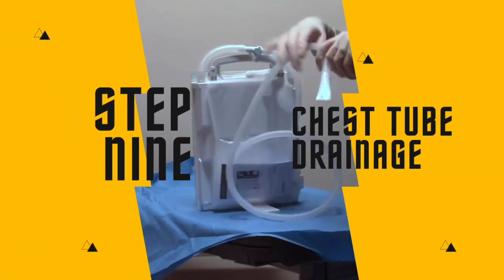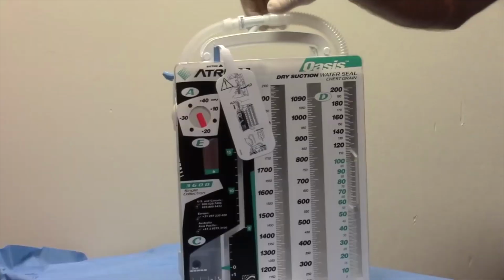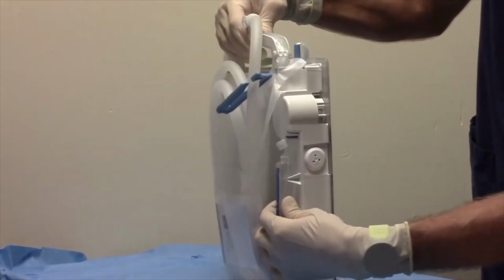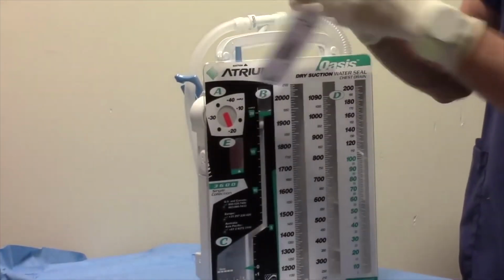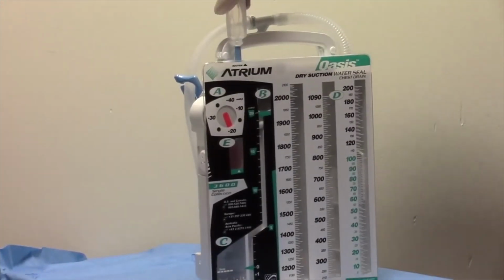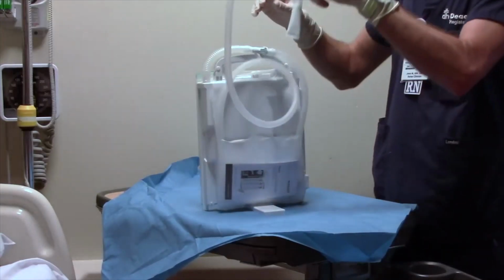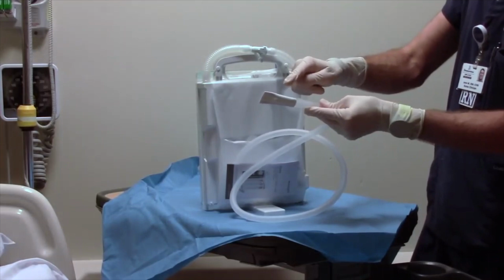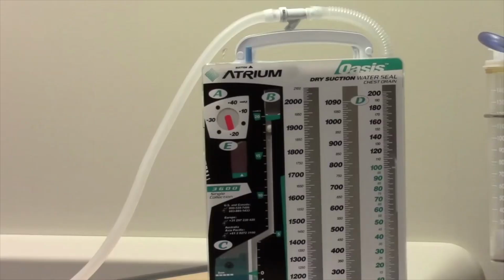Step 9. Chest tube drainage. Connect the chest tube to a water-sealed device.